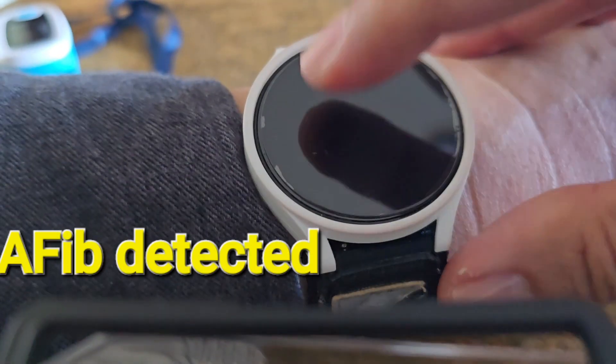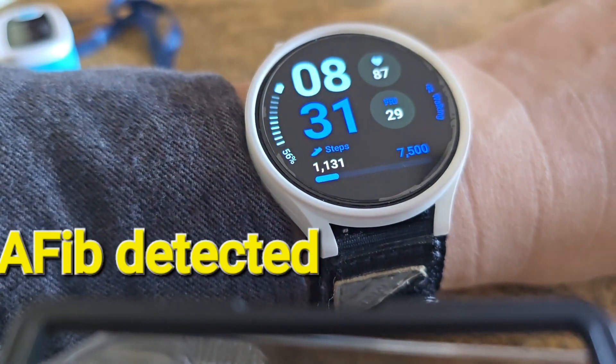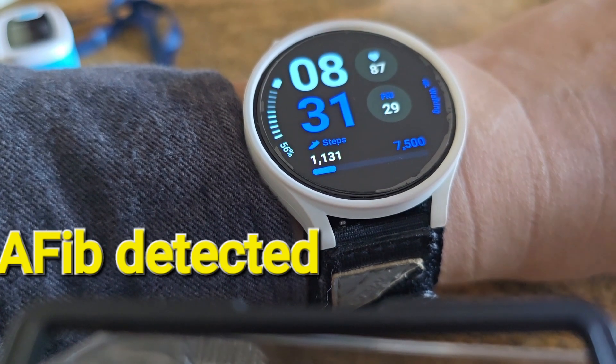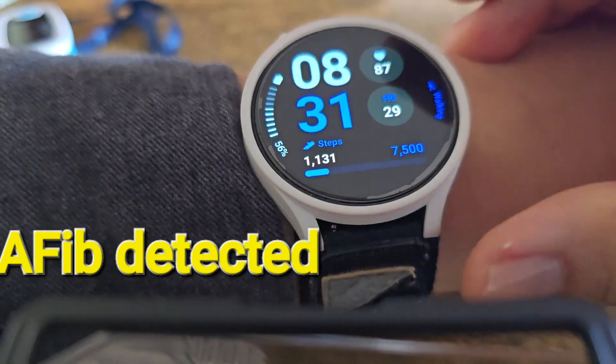I just want to show you my Samsung watch and how it catches A-fib. I'll demo it — unfortunately I do have A-fib right now.